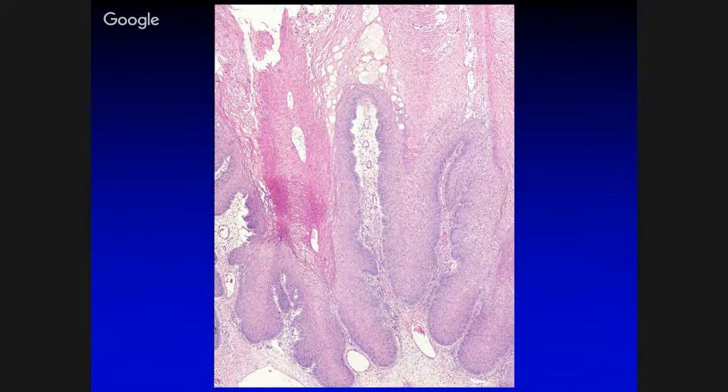You see a very keratotic lesion, whether it's in the oral cavity or the larynx, and the way that the keratin is described, it has this layered or tiered effect, or if in Europe in particular, the church spires, you see the terminology church spire keratosis. That's just the tiered layering. The epithelium, as I will show you, is perfectly bland, but elongated, and in some instances takes on the shape of elephant feet.